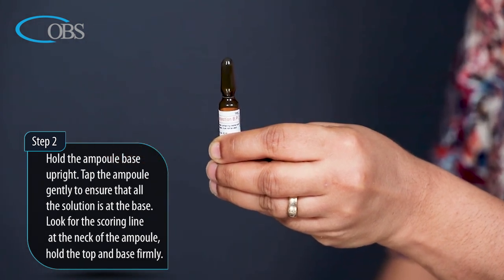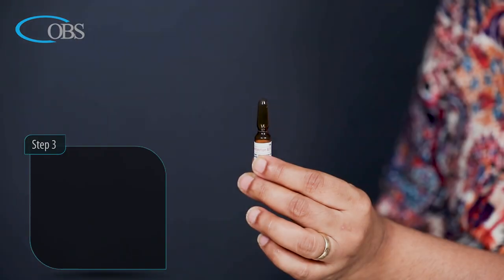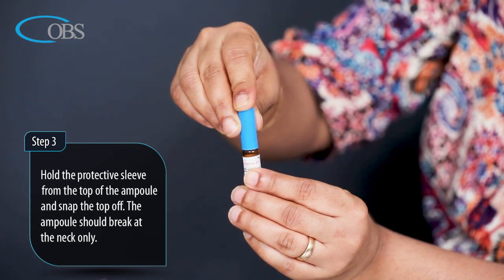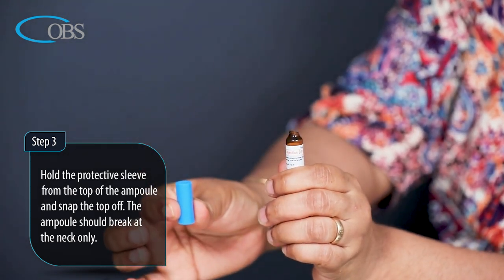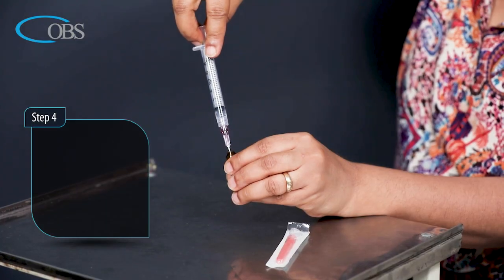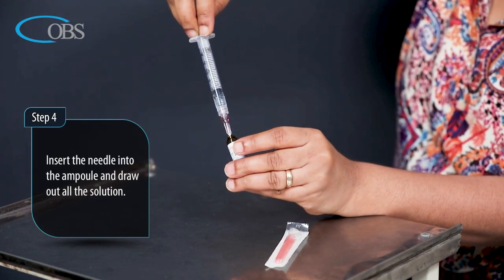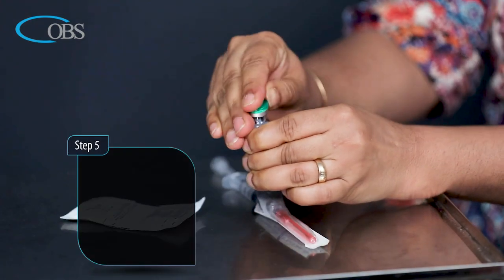Look for the scoring line at the neck of the ampoule. Hold the top and base firmly. Step 3: Hold the protective sleeve from the top of the ampoule and snap the top off — the ampoule should break at the neck only. Step 4: Insert the needle into the ampoule and draw out all the solution.